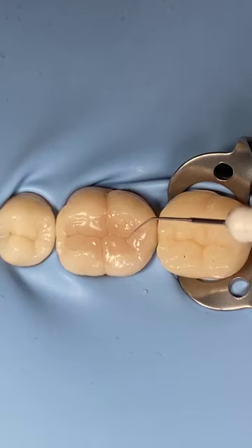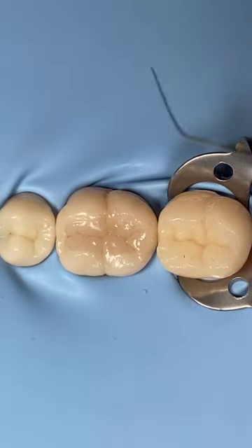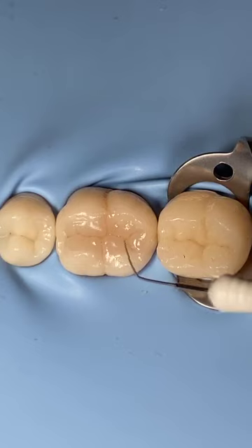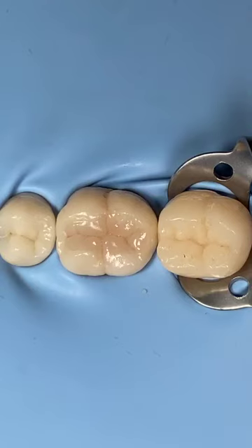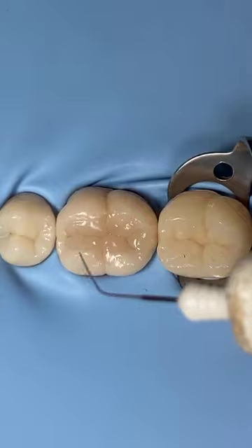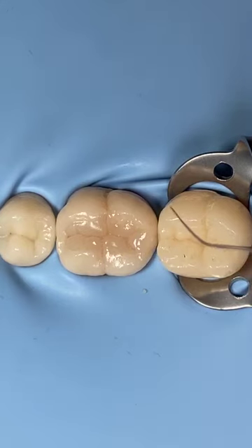So remember the dot technique. Just create 3, 4, 5, or 6 dots before you scratch that composite. Before you draw the composite, so you will have a very thin separation between each cusp. If you get used to this technique, you can easily create a secondary anatomy, you know. But I want you to understand the primary anatomy first. After you do it over and over again, you will eventually get used to this technique, and then you can improvise. You can create muscle, you can create a bulky anatomy, a good anatomy, a very, very aesthetic anatomy.